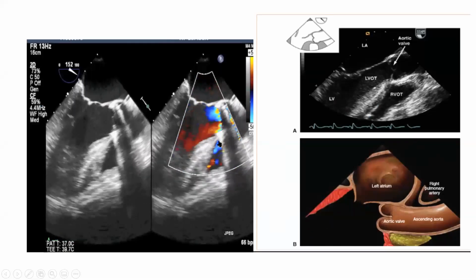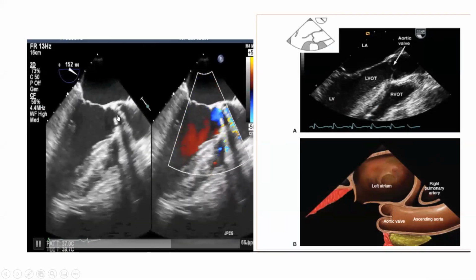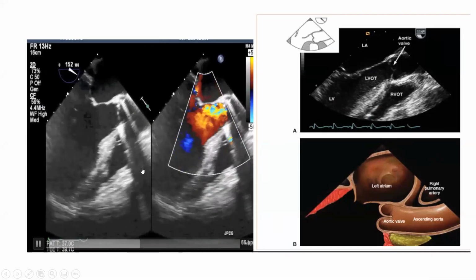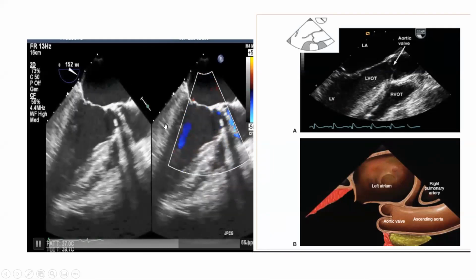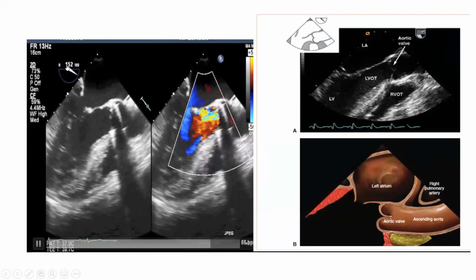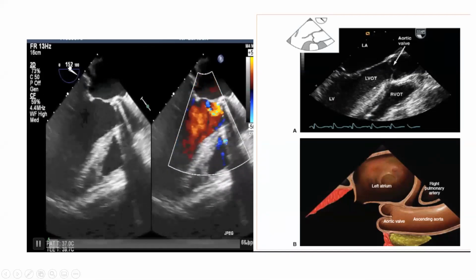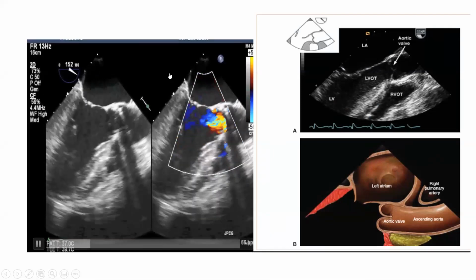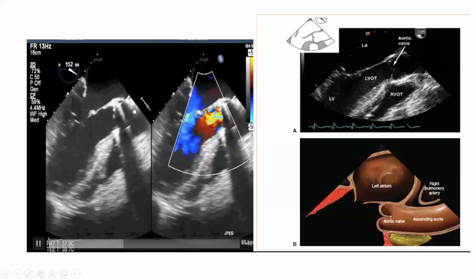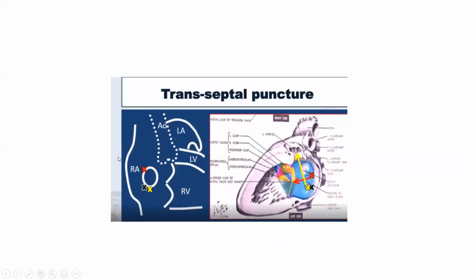And here, what is this? Tissue or mechanical? Aortic mechanical. Mechanical. And there is a paravalvular leak. And what is the view? Now we are at 150 degrees. So first you see the degree to know what the view is. Usually from 110 to 150, you will find the 3-chamber long axis view of the LV.